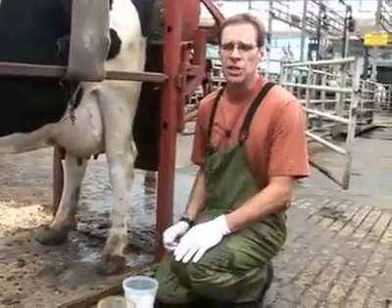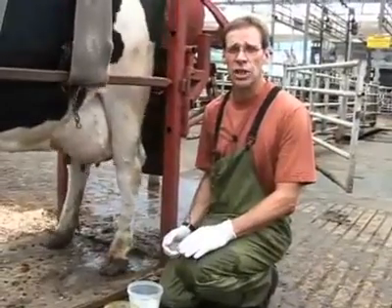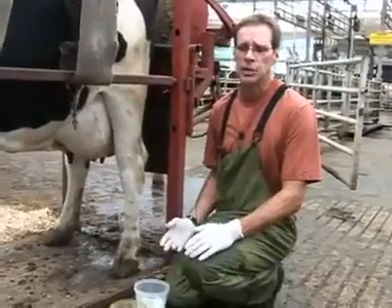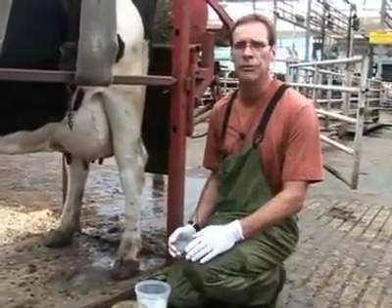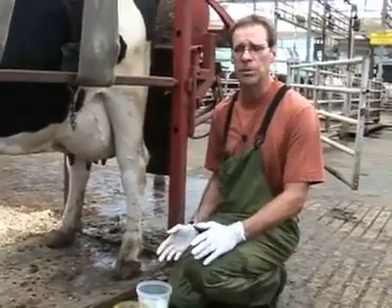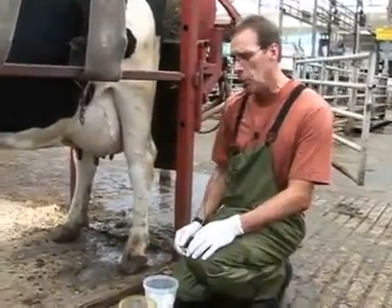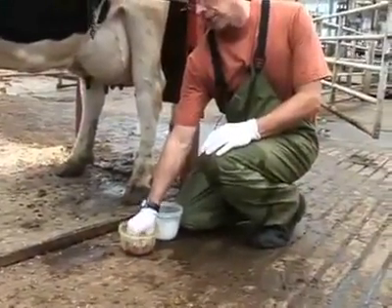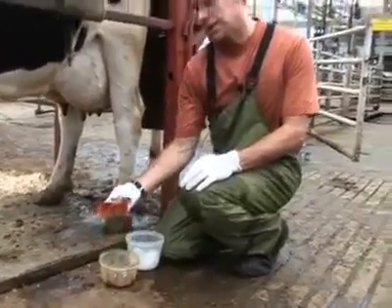If there's an indication that a cow has some sort of infection in the mammary gland, mastitis, our next step would be possibly to take a sample of that milk to submit for microbiology to determine maybe what pathogen has caused that infection. To take a sample from a quarter, you're going to need to clean the quarter aggressively in order for no surface pathogens to contaminate our sample.